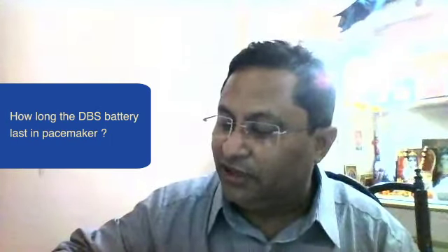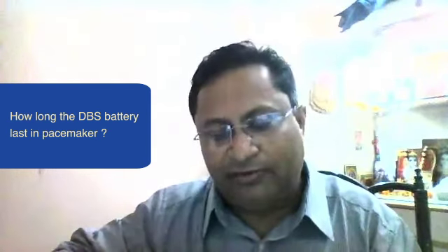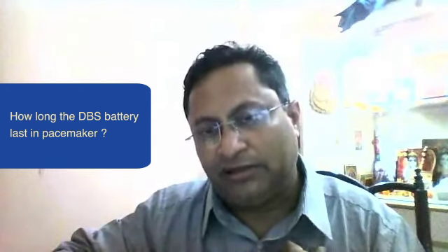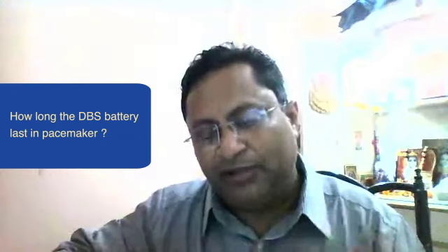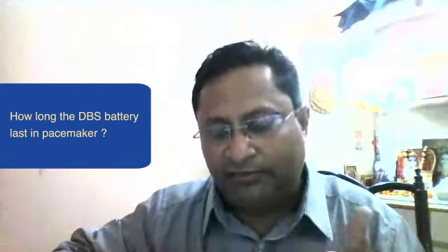Next question is, how long does a DBS battery last? I already told that a rechargeable battery is for lifetime, but it requires repeated charging every week or every 5-6 days. It depends on what voltage it is on.